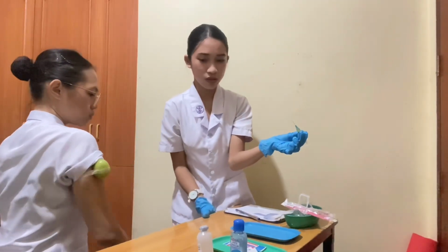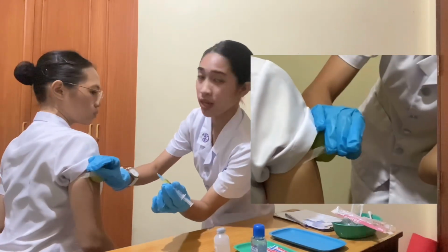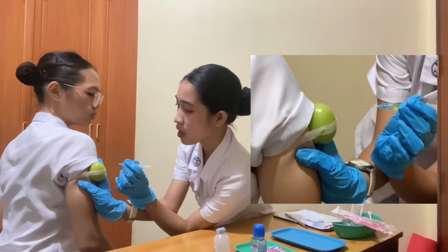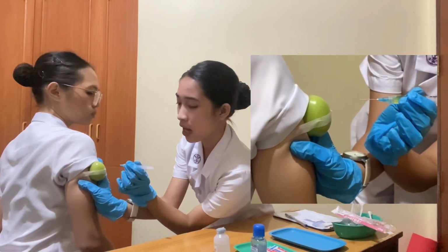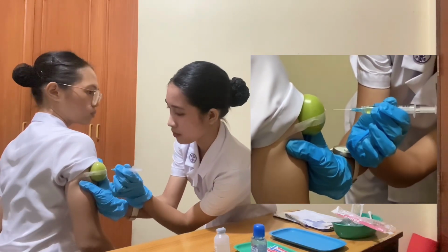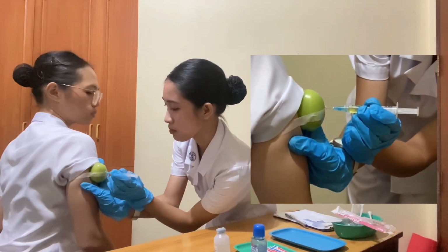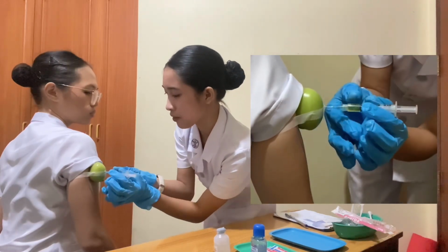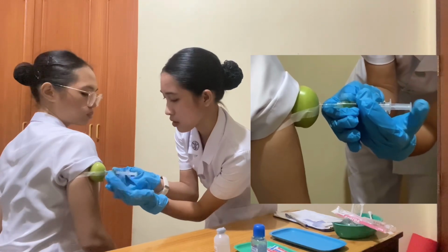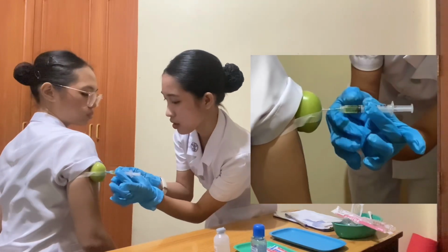I'm just going to do a Z-track method by doing like this. And then, ma'am, mag-inject na ko, ha? 0.5 ml, then 90 degrees. Okay, ma'am, mag-inject na ko, ma'am. Aspirate it. Then inject.